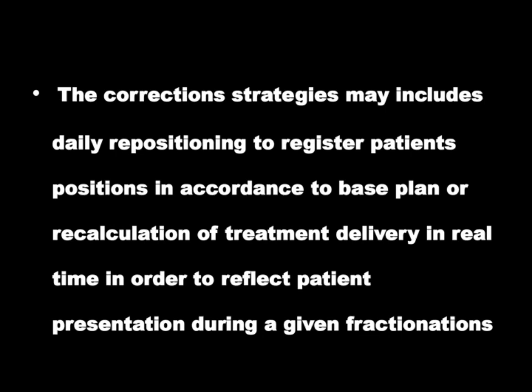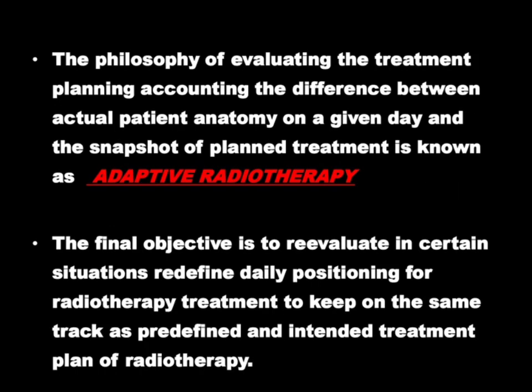The reason is that the target may move during the treatment due to respiratory breathing, peristaltic movement for GI tumors, bowel movements and cardiac pulsations for mediastinal structures, and urinary bladder and rectal filling may lead to movement of a prostatic tumor.